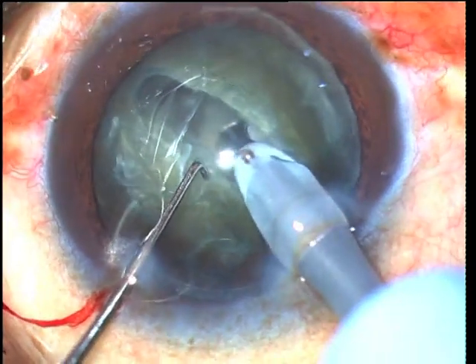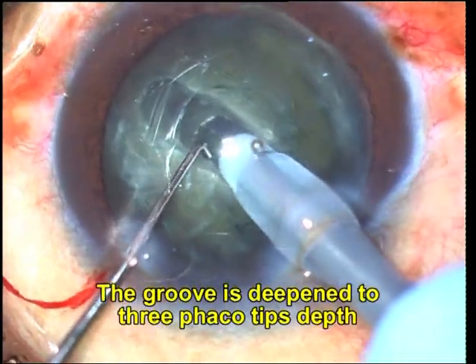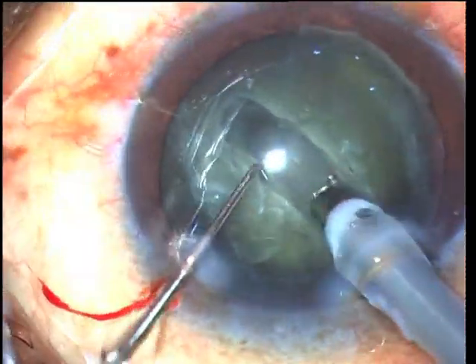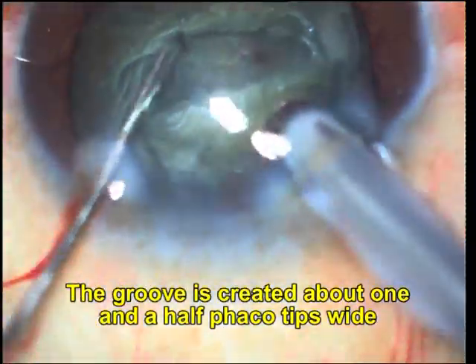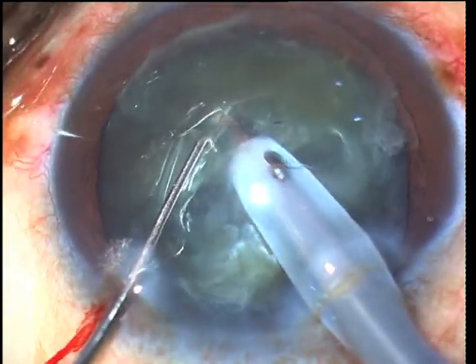The groove is determined to be adequately deep once it is about 3 phaco tips deep and once a clear red reflex is seen through the groove. Once deepened inferiorly, the nucleus is rotated and deepened in the opposite direction, and once the first groove has been created, the cross groove is created at 90 degrees to it.